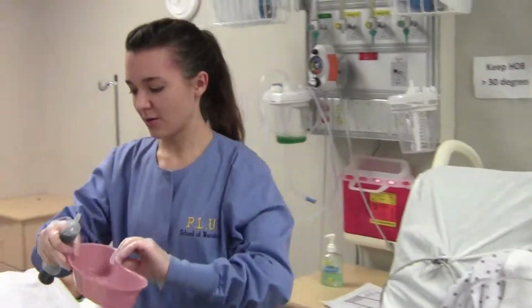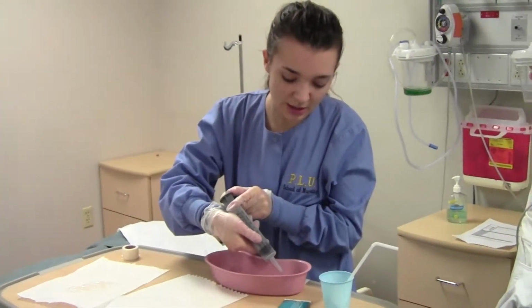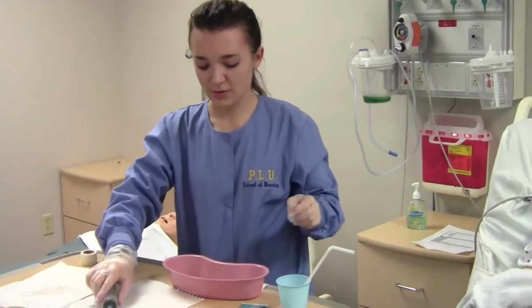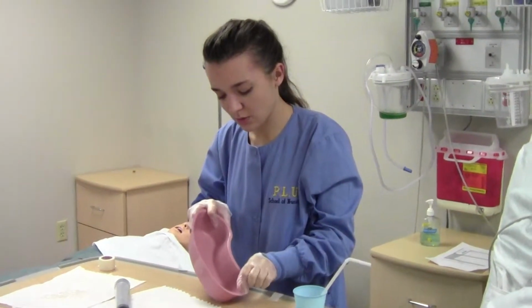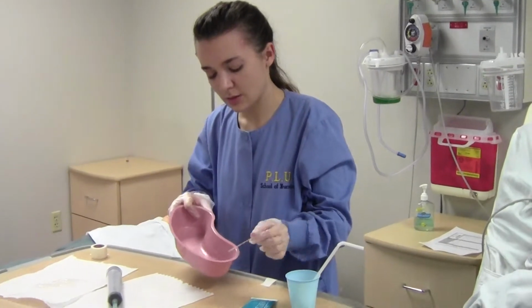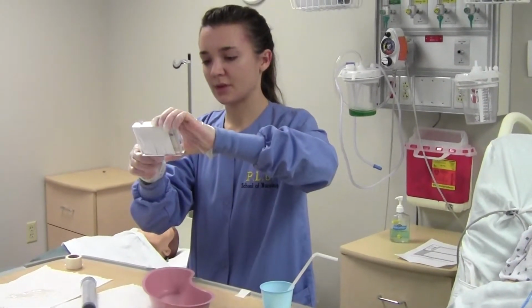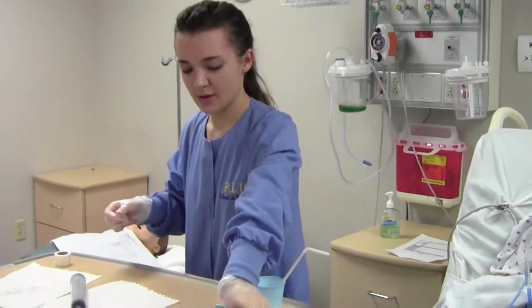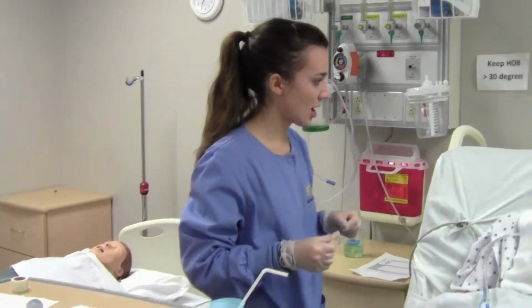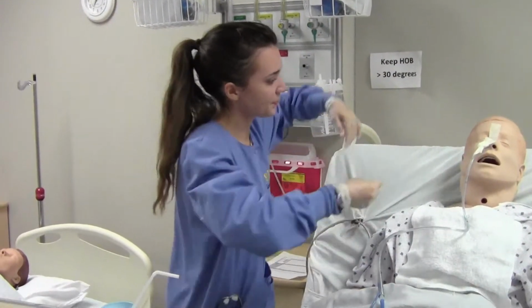Oh, good. Alright, so we're going to take the stomach contents, or what we assume it is. I'm seeing that it's green, so I'm definitely believing that it is. We're going to do our pH test just to double check. So we have our green contents. And doing that, now I'm comparing it. And we have a pH about 5, so I'm going to say we are in the stomach. Wonderful. Okay. Great job, Mr. Templeton. So what we're going to do is we're going to definitely secure that into place now.